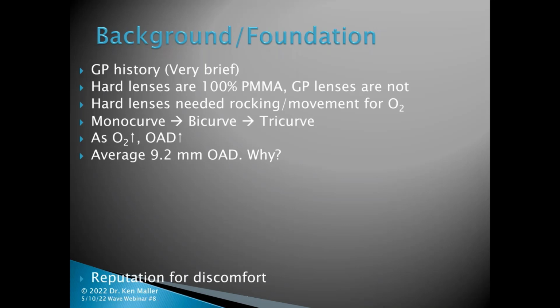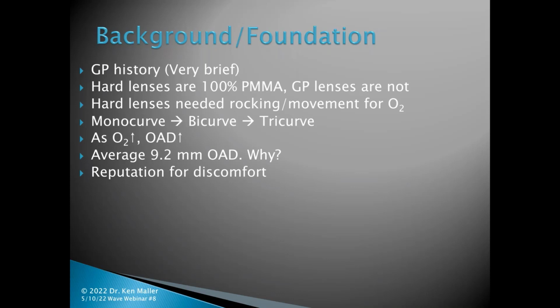With the GPs, an average diameter was about 9.2 millimeters, and the question is why? They also had a reputation for discomfort and still to this day enjoy that reputation, which I might casually add, totally undeserved.